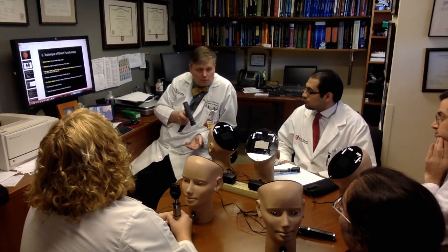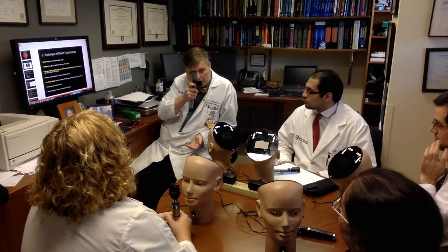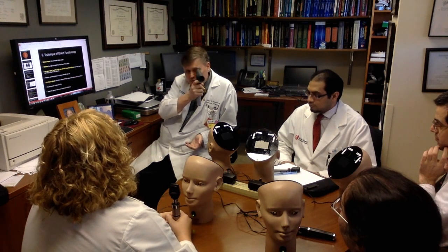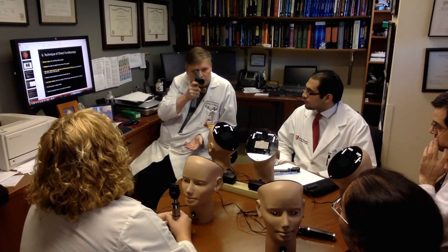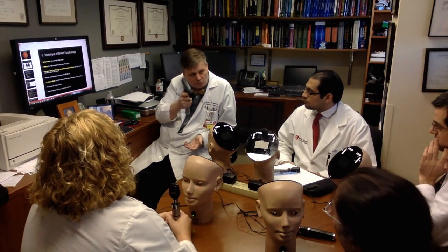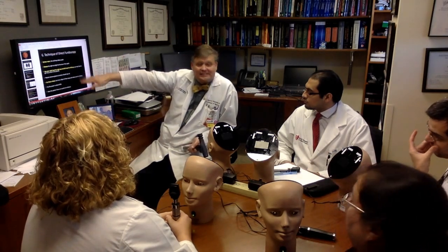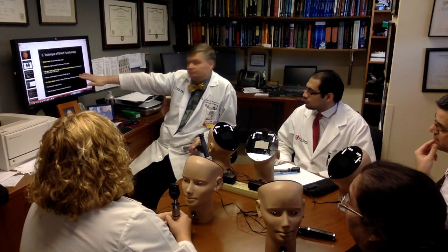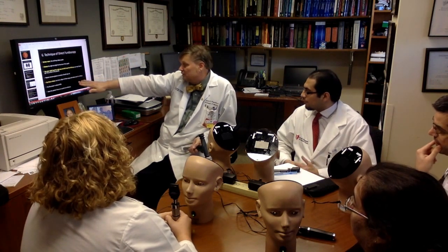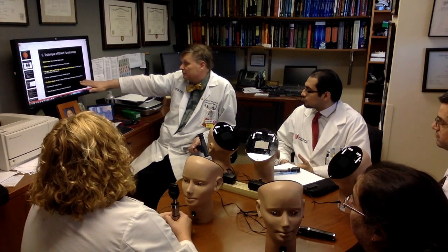In general, when you're looking at the patient's right eye, you will use your right eye. You're looking at their left eye, you use your left eye. The panoptic can kind of get away with using your right eye for both if you want. But in general, it's right to right, left to left. If the patient has glasses, they have to take them off. If the patient has contacts, they should keep them in. If you have glasses, it's up to you. Yours should probably stay on, okay? Your glasses should probably stay on.